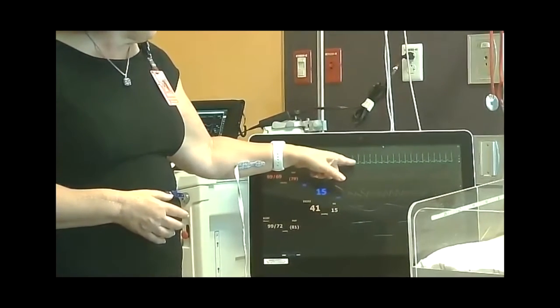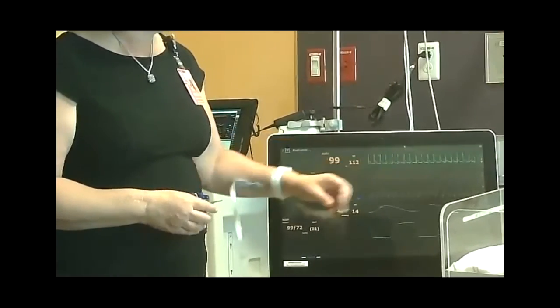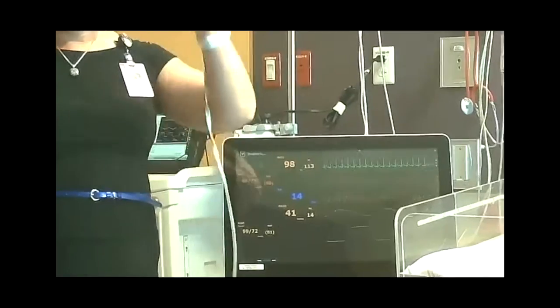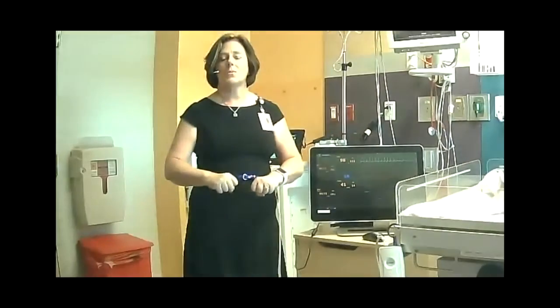The first is the little wave in front of each tall wave. The little wave shows the top two chambers of the heart fired and emptied into the bottom two chambers. You want that to happen because up to 30% of the blood the heart's going to push around happens with that fill. The top has to squeeze to fill the bottom, so then the bottom can squeeze out.